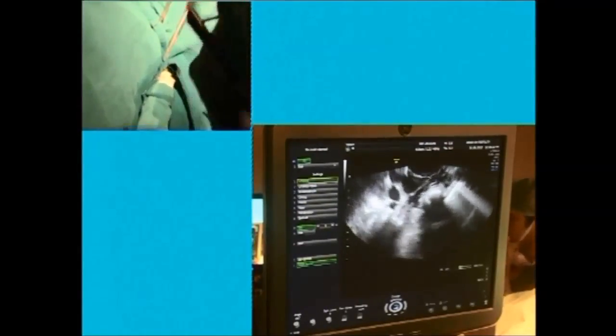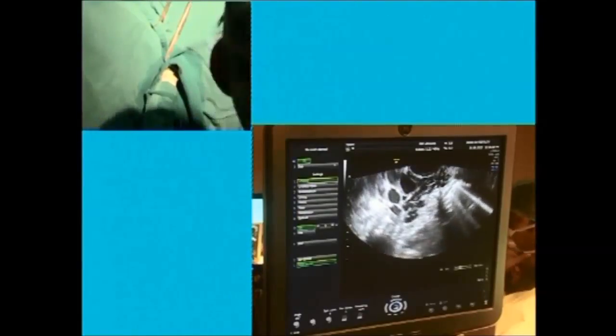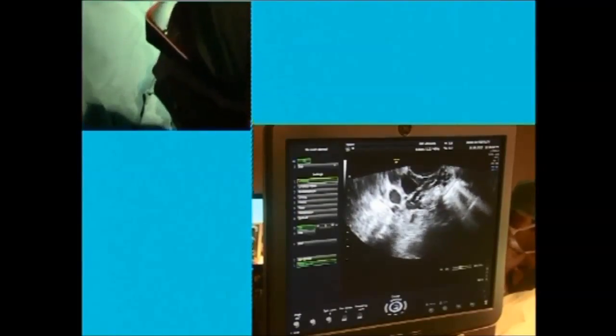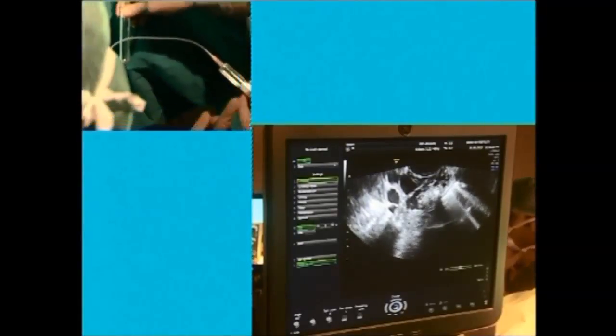First I will go into the follicle, I will aspirate it. The tube which will collect — I would like you to show the tube as well — and then I would like you to show the injection. This has a PIP.